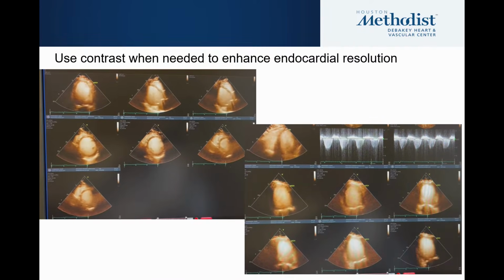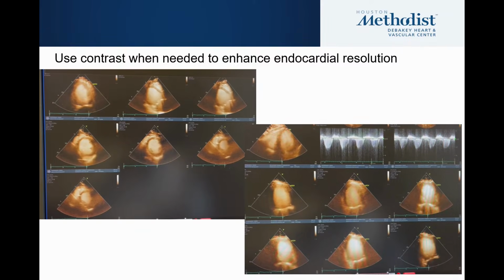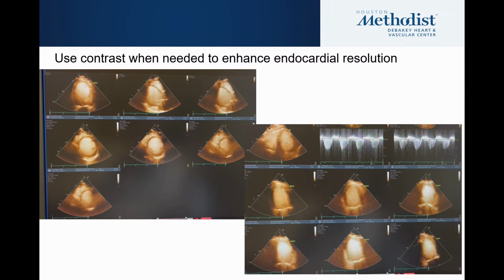And the second important thing is use contrast whenever you're concerned that you are not getting the maximal enhancement in terms of the cavity size and contractions. So contrast, of course, is very, very helpful, and I'm proud to say that all of you are very much contrast-minded and you use it quite often.